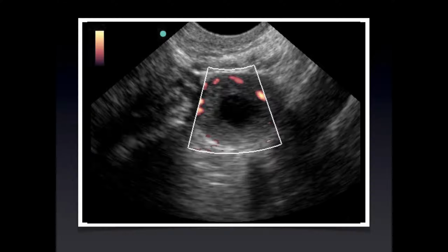Typically, adnexal evaluations are easiest in the coronal plane. In this view, for example, we're moving towards the left side of the patient. So you see the uterus here and the ovary here and iliac vessels here. The easiest way to find the ovaries is to scan out into the adnexa until you identify the iliac arteries. You're going to be just next to the uterus here, and then the iliac arteries and uterus form this 45-degree plane here. And then you're just going to scan up and down that plane, and somewhere within that plane the ovaries have to be located unless they're obscured by bowel gas.